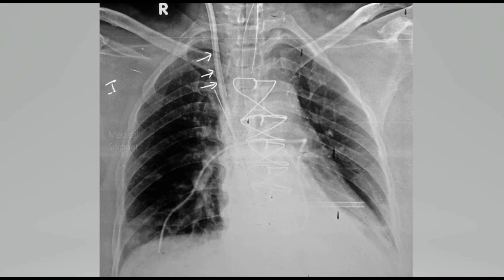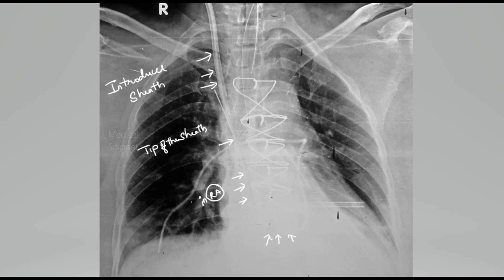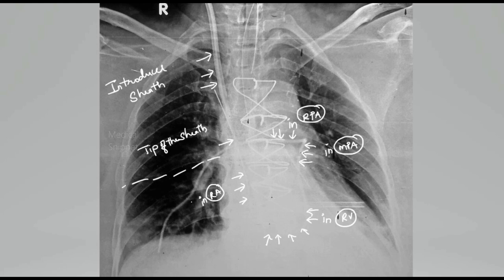This is the introducer sheath through which the PA catheter is inserted. The PA catheter passes through the right atrium, then the right ventricle, and now traverses through the main pulmonary artery, entering the right pulmonary artery. The PA catheter should be lying in one of the main branch pulmonary arteries.